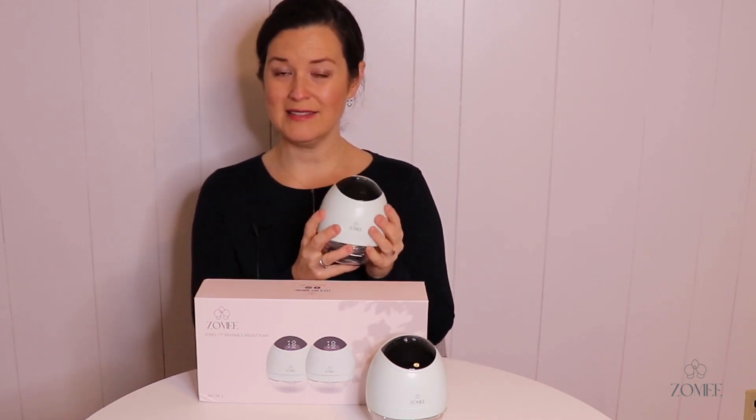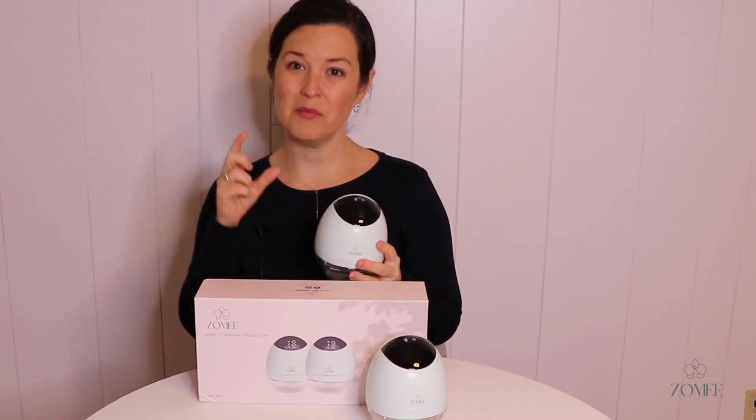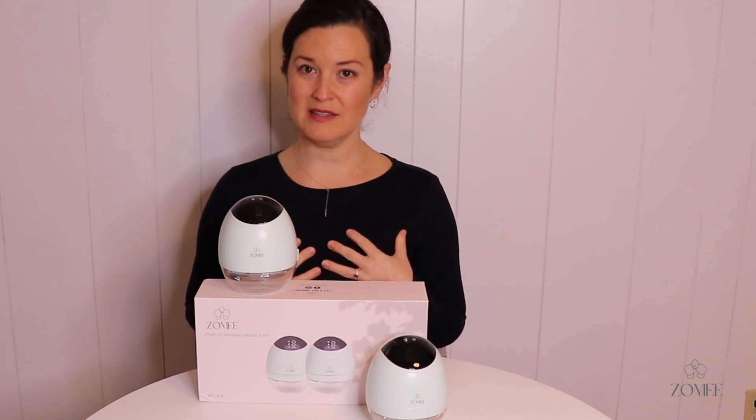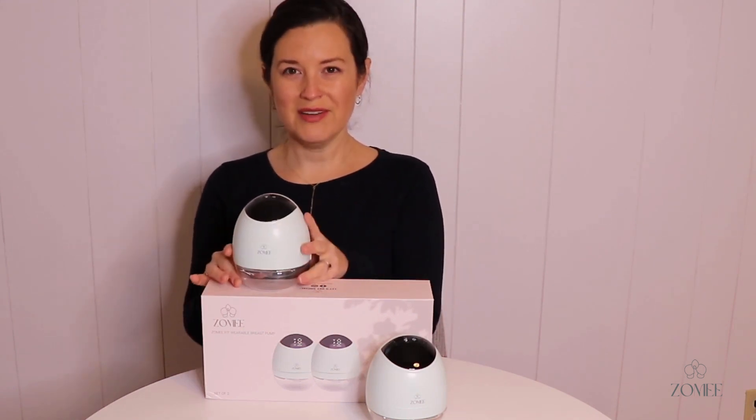It's BPA free, easy to clean, and easy to take apart and put back together — I'll bring you a video on assembly. It's pretty lightweight so it shouldn't weigh down your bra, but it does come with little bra extenders in case you need a little extra room. You want your bra to be snug but not too tight to get good suction.